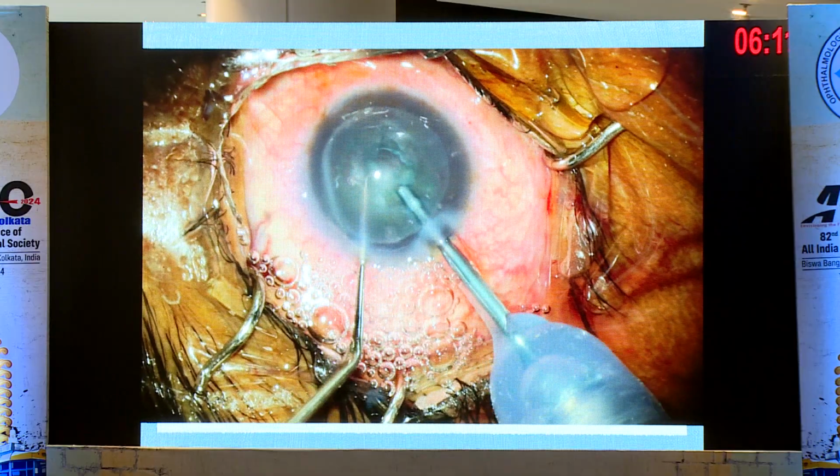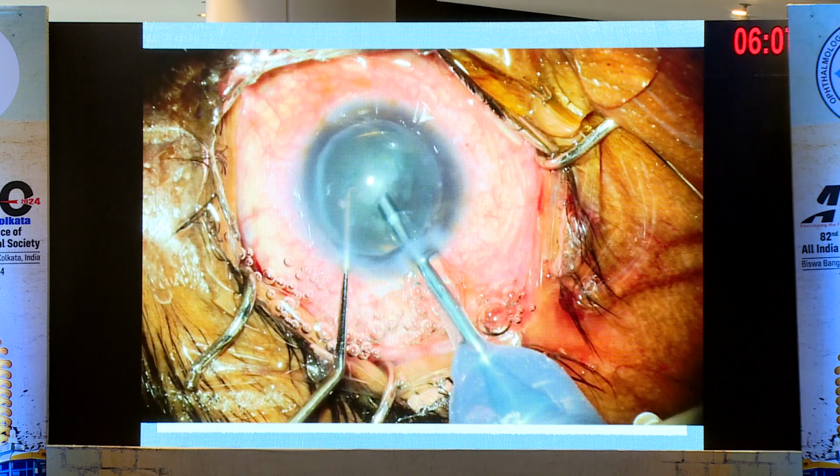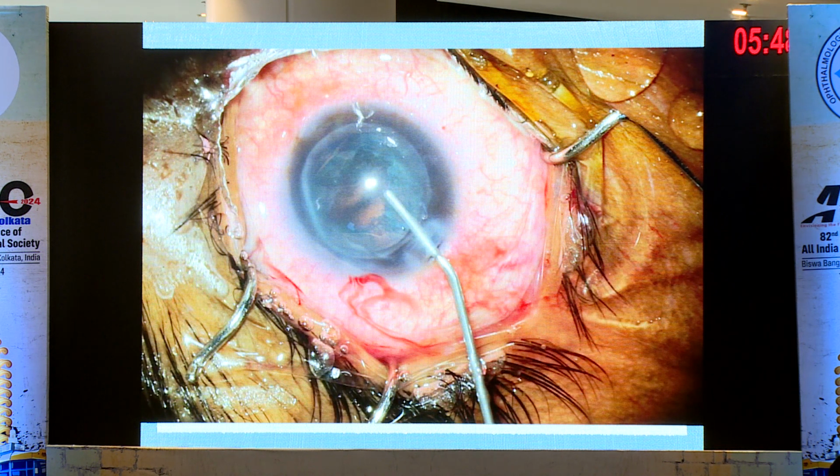Try to direct your phaco tip away from the endothelium, so you might want to face it either downwards or sidewards. Every time you introduce your phaco probe, try not to go in with irrigation on. Sometimes the flow of your irrigation can detach the edge of the graft, which is something you just don't want to end up with during a phacoemulsification in a post-DSEK eye.